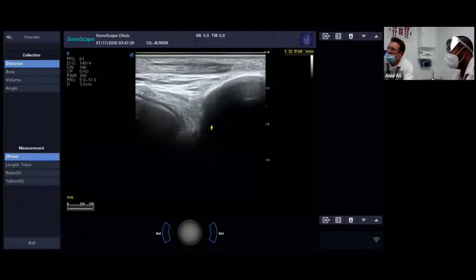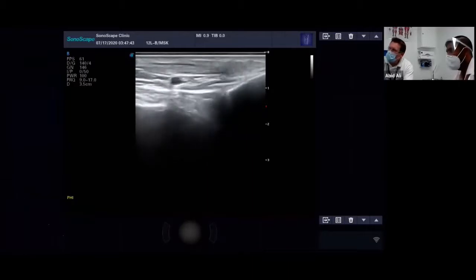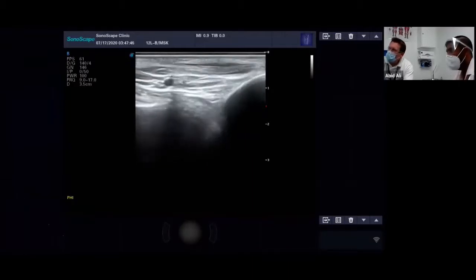There. About 10 mil we've got there. I'm probably a bit too high for that, but... Yeah, and bear in mind your ankle is plantar flexed a little bit as well, so that's looking a bit bigger. We just shallow up the groove. I think on average it's about 7 mil, I think, is normal.